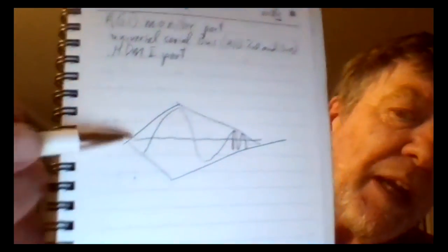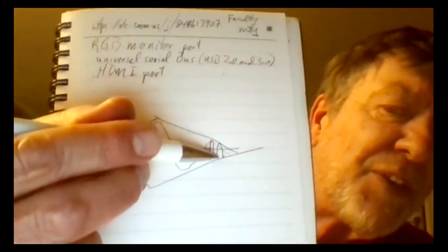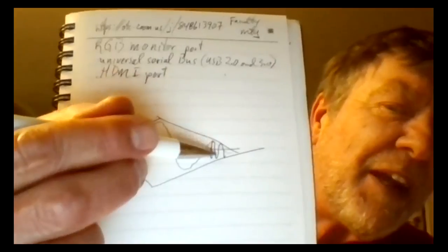So if I make a loud, low frequency tone to activate the cochlea, that's going to easily mask. Its traveling wave is going to mask the peeping high frequency canary.